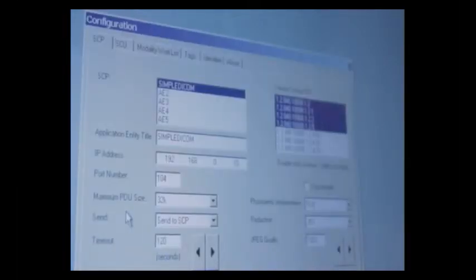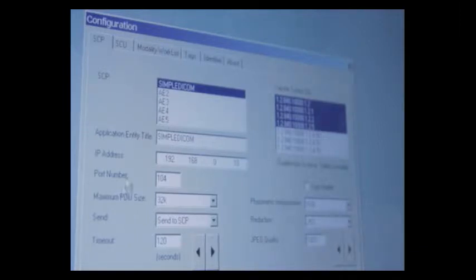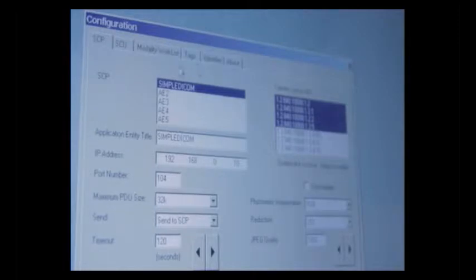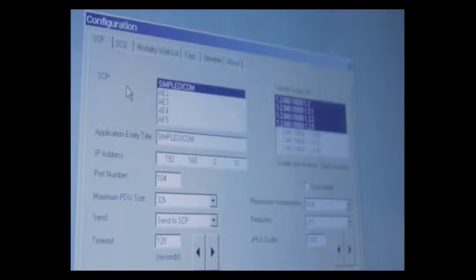This will bring up the SCP screen. You'll notice the tabs at the top here. We have SCP information, SCU information, Modality Worklist information, Tags, Identifier, and About. We're first going to focus on this SCP screen as this is the DICOM Image Send screen.